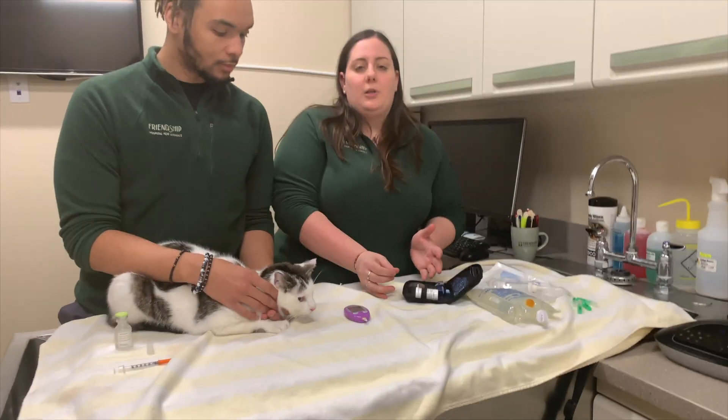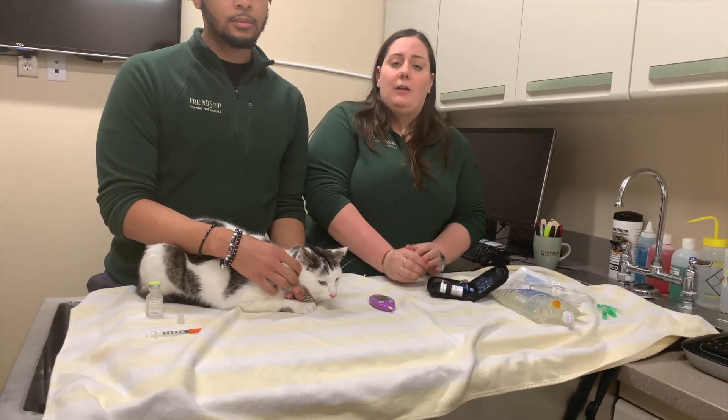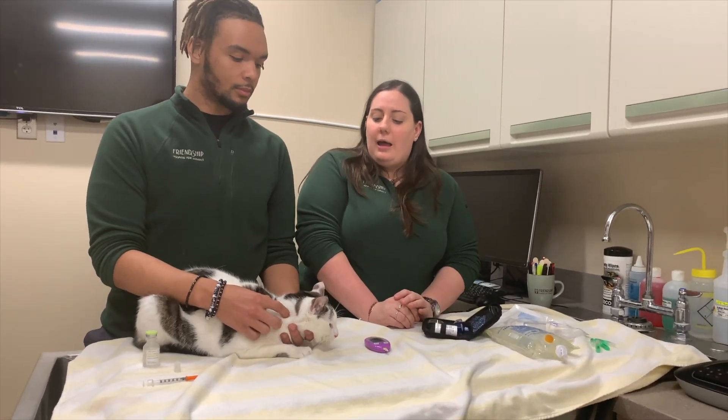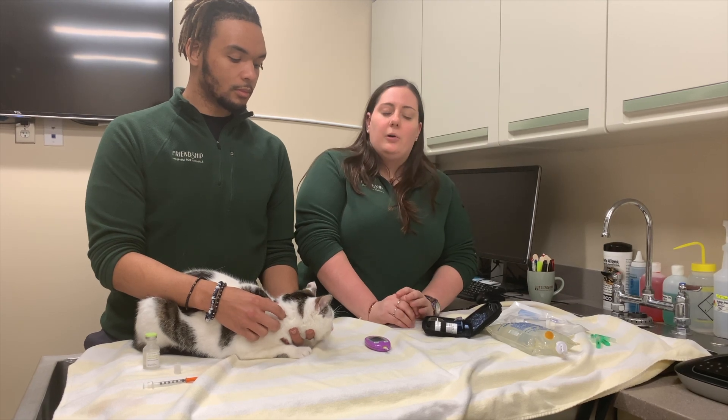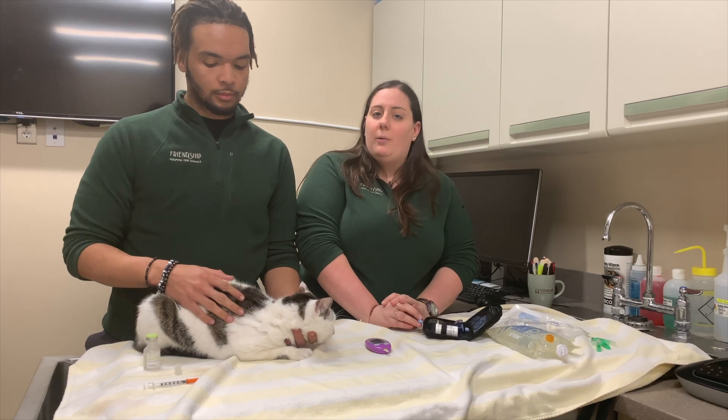When we do blood glucose curves at home, we like to get a reading right after insulin is given. Insulin should only be given if your pet is eating well. We do like to check them every two hours for about five to seven readings throughout the day. That's something the Internal Medicine Service can talk to you more about.